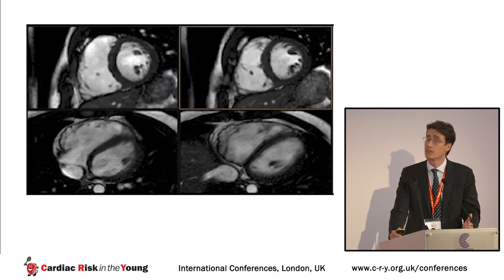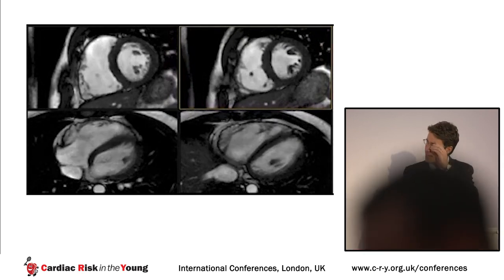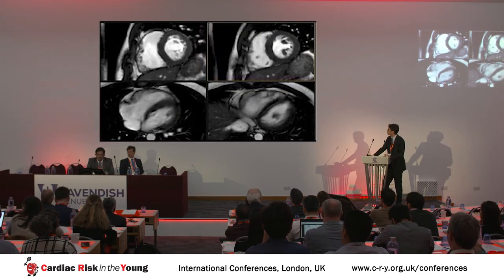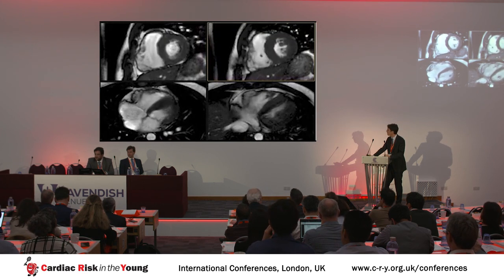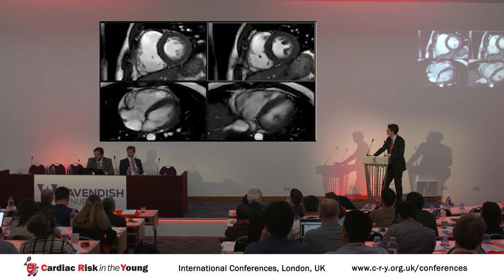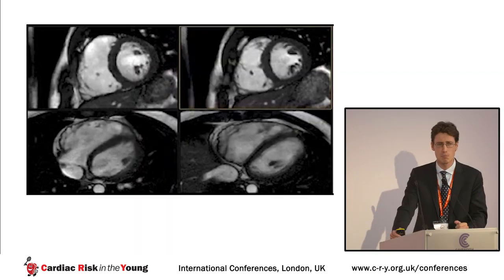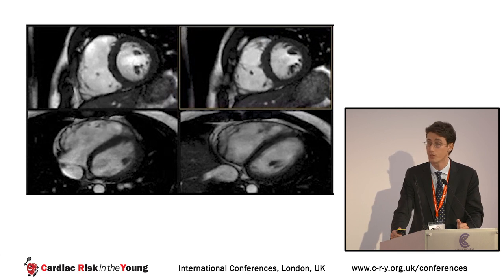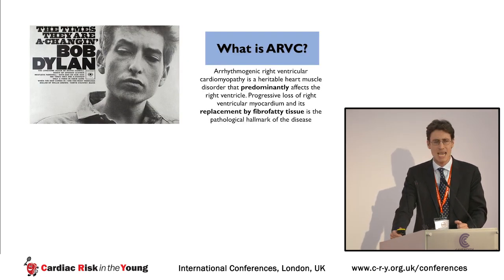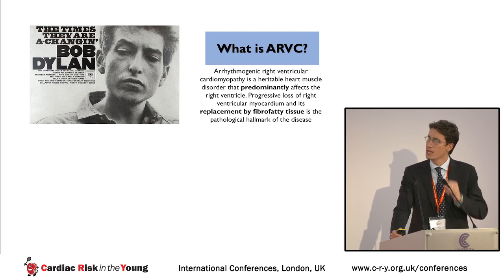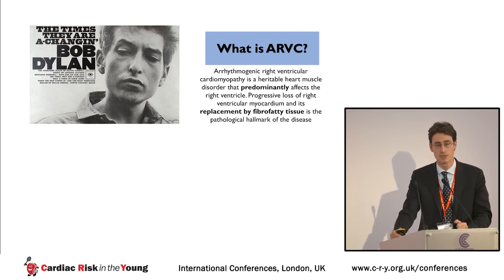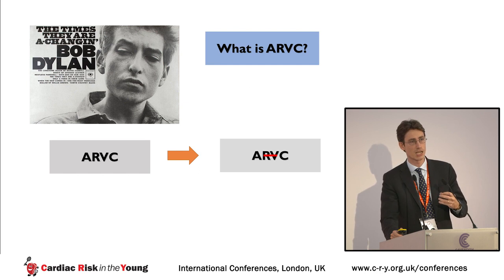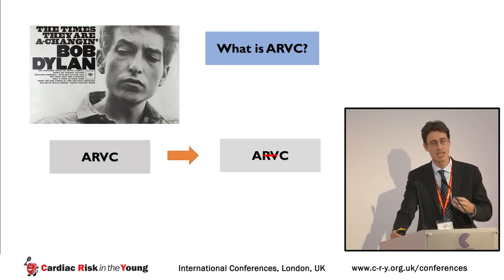This is a classical CMR case of ARVC. We see a right ventricular region of wall motion abnormality at the base of the right ventricle with some right ventricular dysfunction, but right ventricular dilatation is not particularly significant or marked. This patient would probably not fulfill Task Force Criteria, which is relevant to underscore something that is changing in the nomenclature of this disease.